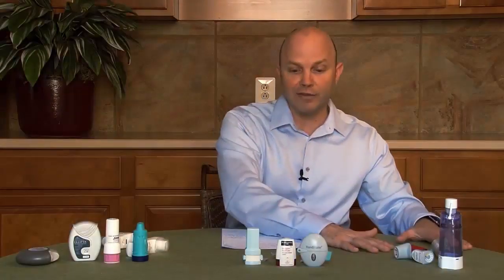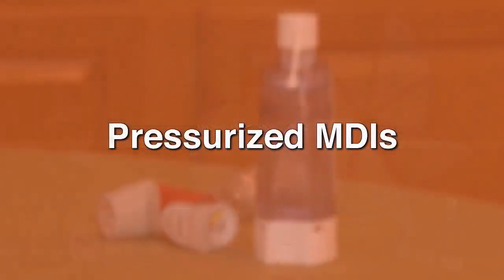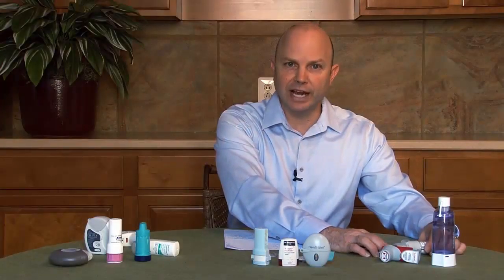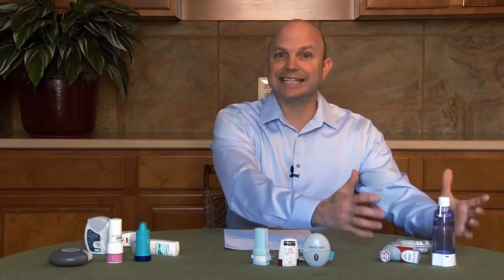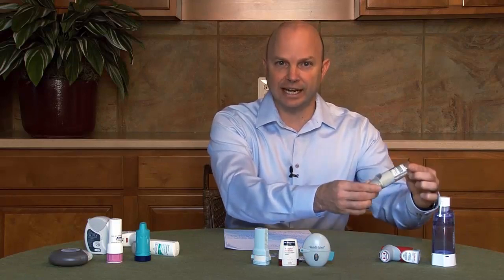So now what we're going to do is take a look at each of these different groups of medications, and then you're going to see tutorials on how to take each specific device and the steps properly needed to inhale the medicines into your lungs. Now let's focus on the pressurized MDIs. These come in 3 different variations. You'll either have a CFC inhaler, an HFA inhaler, or the soft mist inhaler.